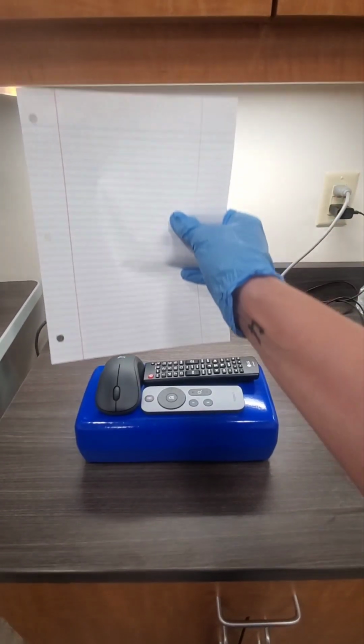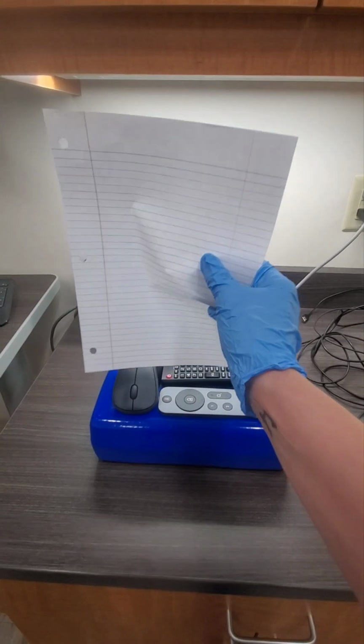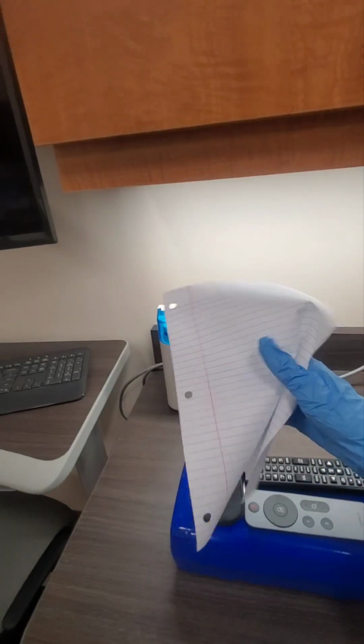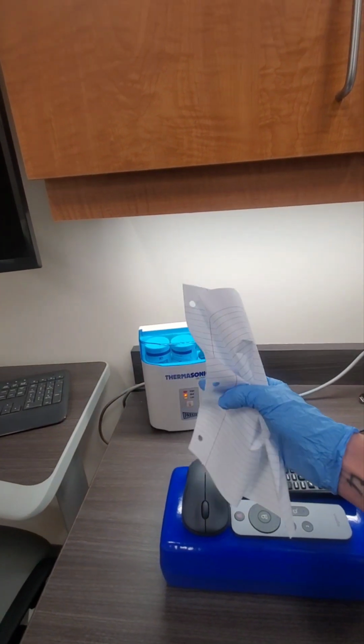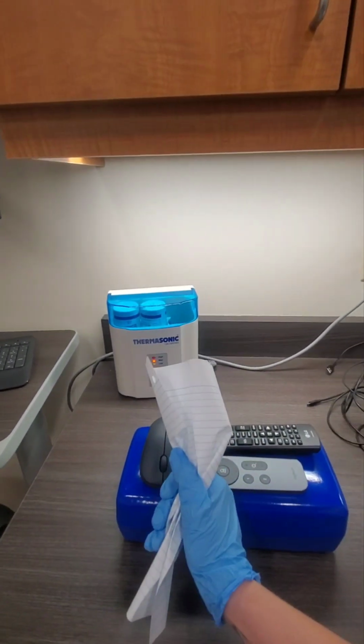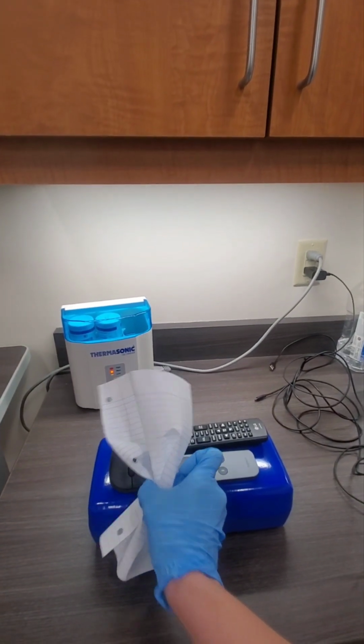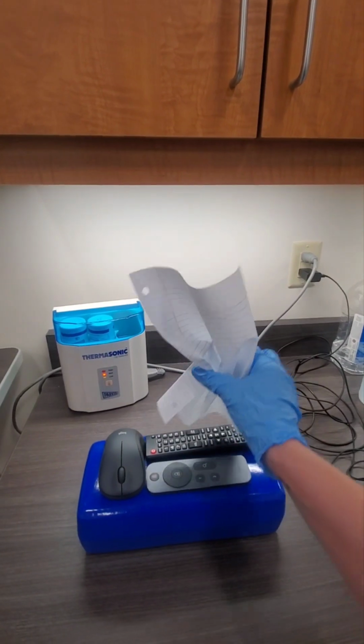Now if my sound beam's coming this way and I need to resolve it between these two things, I need to put a tight waist on that sound beam and pull it in tight so that side by side, that lateral resolution can fit between that mouse and that remote so it can resolve each one.